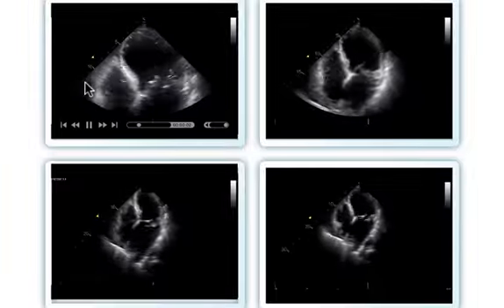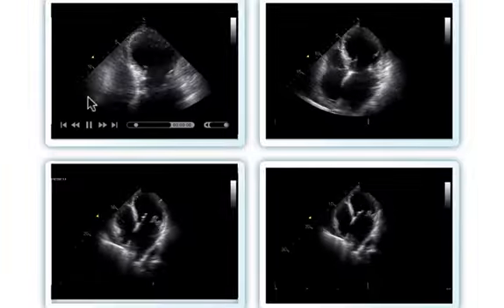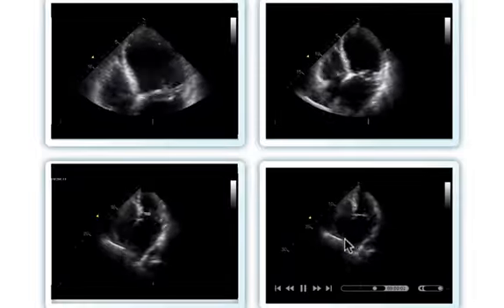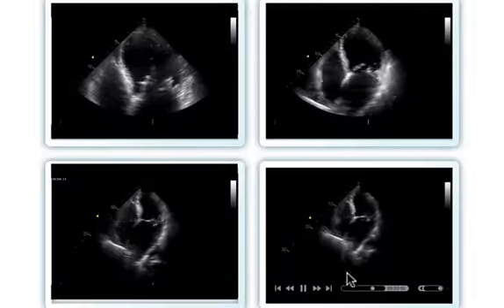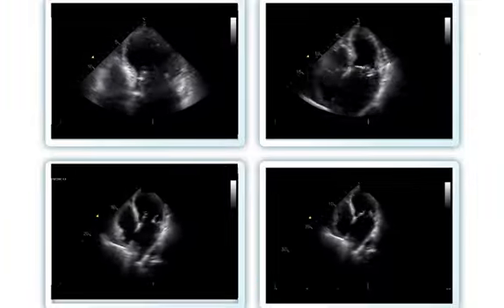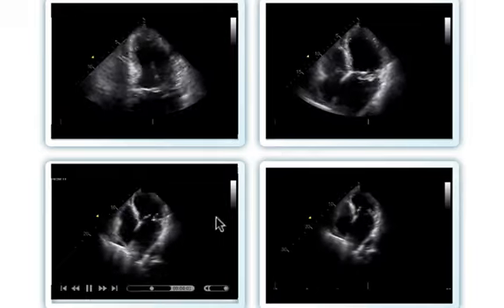You can see that in this case we do not have the entire heart on the screen, while we do have the entire heart down here, but we also have a lot of information which you do not need. So in reality, you should use some kind of an intermediate setting, for example, a setting like this and maybe like this.